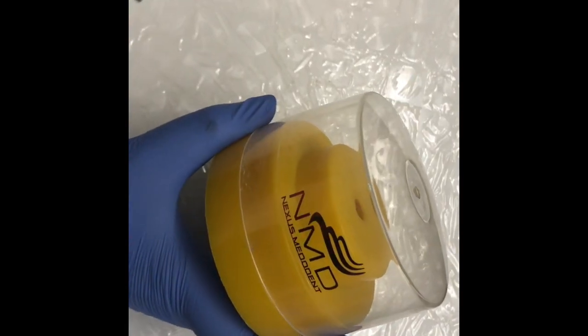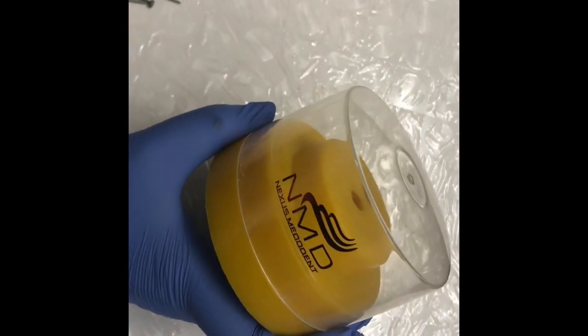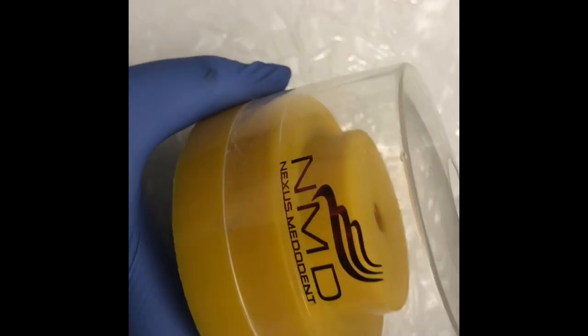Hey friends, back again with one more product. This is the Bird Holder Round from NMD Nexus Metodon.